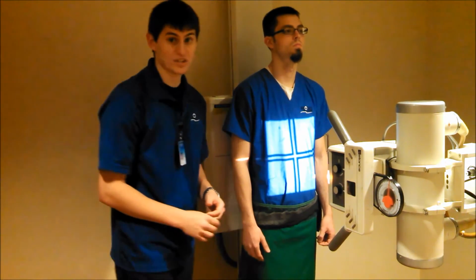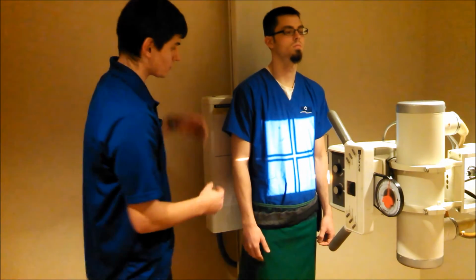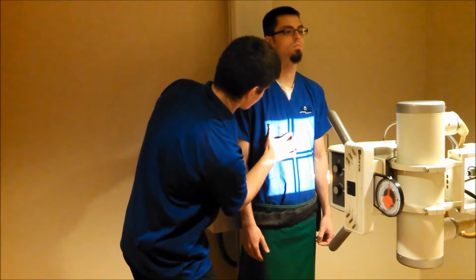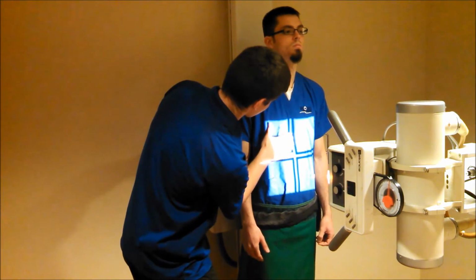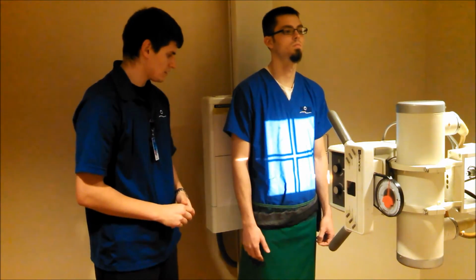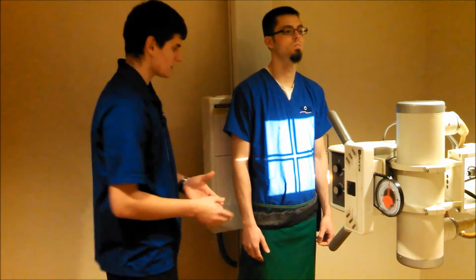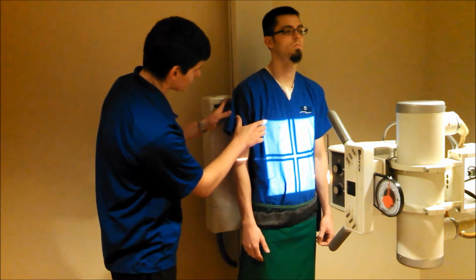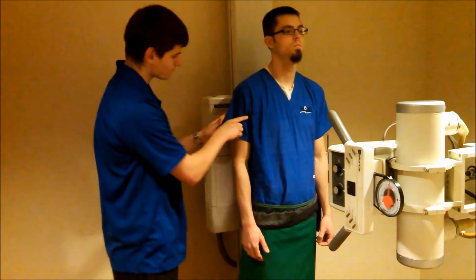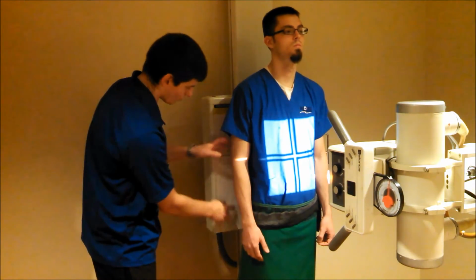We want to make sure our patient is centered to the film. So we're going to feel for his xiphoid tip. Yep, he's lined up there. Make sure that we have all the anatomy on there, and a sure way to do this is to make sure that you have light at the level of the axilla, which we do. I'm going to put a right marker.